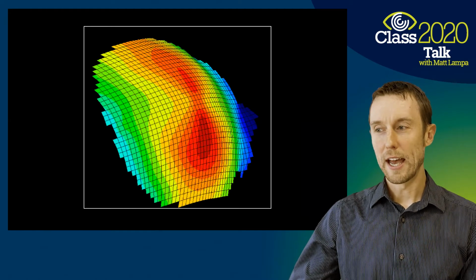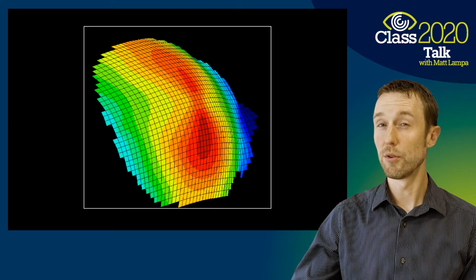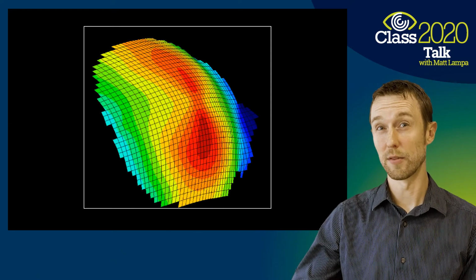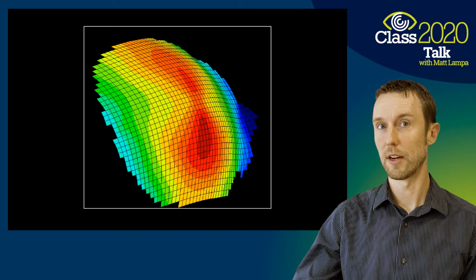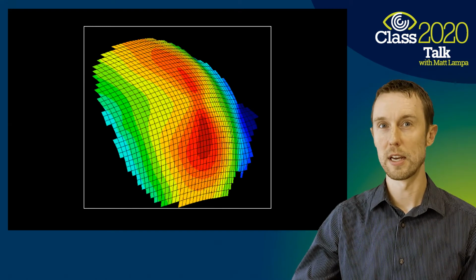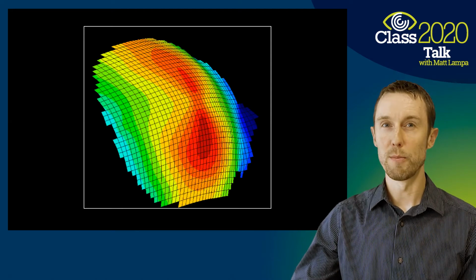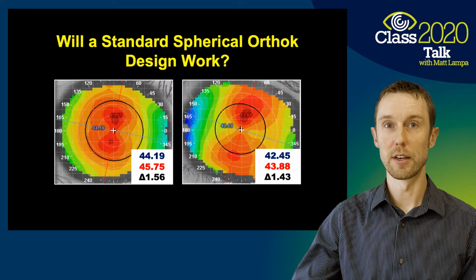What we're looking at, though, is if we were to attempt to land the contact lens on this cornea, we have 2 very different ways of landing the contact lens on this eye. Along the horizontal, the contact lens is going to hit there first in that it's the highest, and then where the contact lens is going to lift off is the portion of the eye that's the furthest down. In this case, it's that vertical meridian, the 12 and 6 o'clock position. And in a corneal contact lens that's worn for daily wear, that might be acceptable, but in the orthokeratology patient, we're wanting to land the lens equally 360 degrees around.